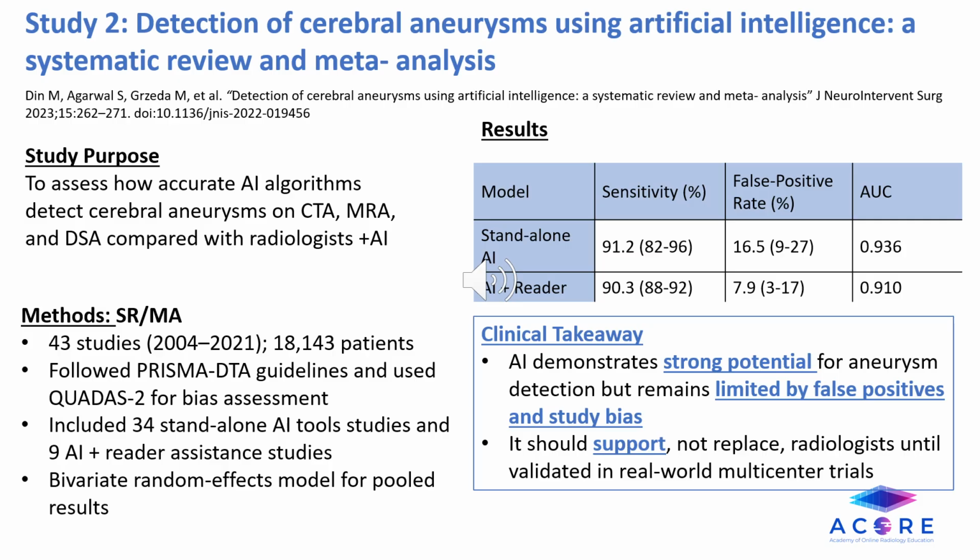For AI-assisted readers, the pooled sensitivity was around 90%, and the false positive rate decreased to about 8%, showing that collaboration between AI and radiologists can help reduce unnecessary alerts. Overall, the analysis showed that AI performance is comparable to that of radiologists, but the authors highlighted several issues. Most studies were retrospective, with high risk of bias and limited external validation.